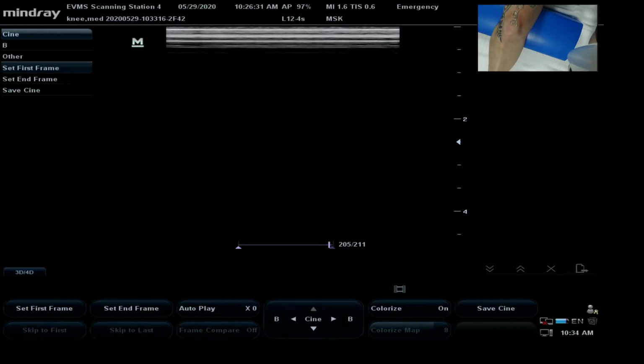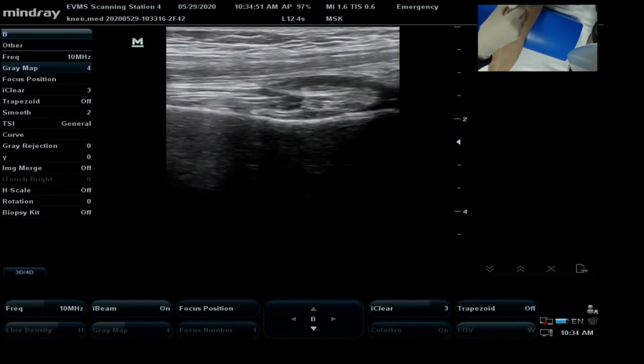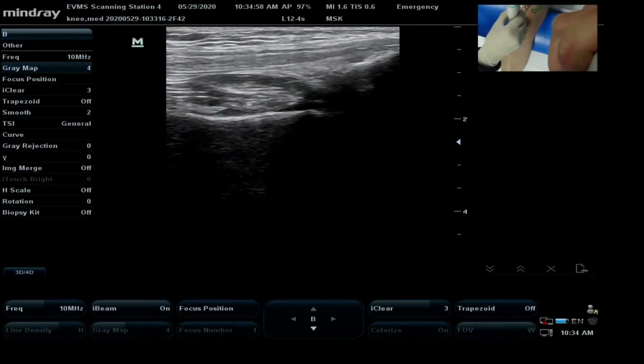because that's where I'm expecting to see my tendon. And let's remember too that the notch on the probe, just as we've talked about in previous MSK, is always going to point proximally. And so I'm going to point that probe proximally because I'm going to take a long axis view, and I'm going to place the probe directly on her knee. And as I move down, I'm going to take a little bit of depth out of this.